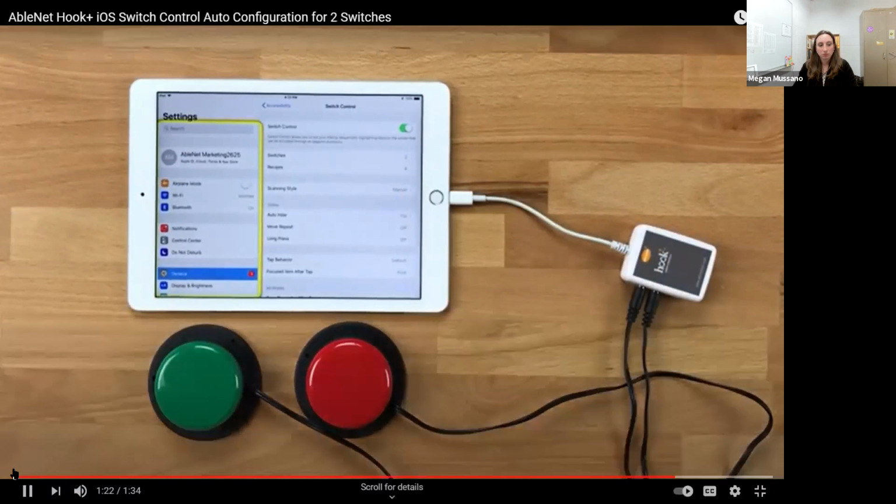switches automatically configure. Now, what Joe just talked about in that video, which is super handy, he talks about how the switches automatically configure. This session, this first part, I'm pretty much just talking about ones that auto configure and talking about the standard programming.